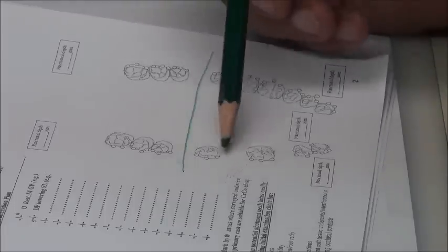I have an option where if the teeth are very strong around it, even the rests I could remove them if this was an upper. Okay? If this pier abutment was an upper tooth, I have also some support from the palate, so I also could remove the rests even. Okay? So pier abutments are challenging. We try to minimize components on them as much as possible.